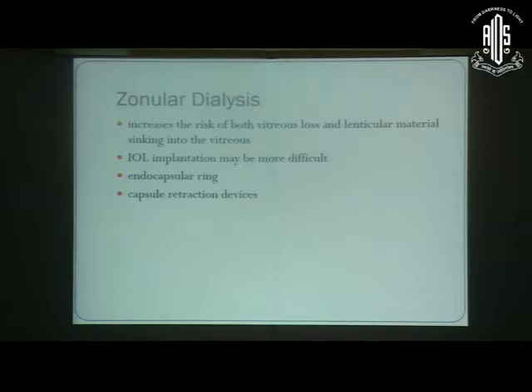Zonular dialysis is more common in traumatic cataract, or if we are not gentle in doing the surgery. Whenever you encounter such a thing, it increases the risk of vitreous loss as well as loss of lenticular material into the vitreous.